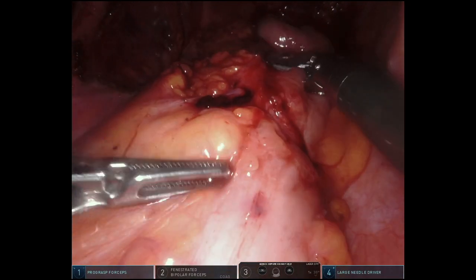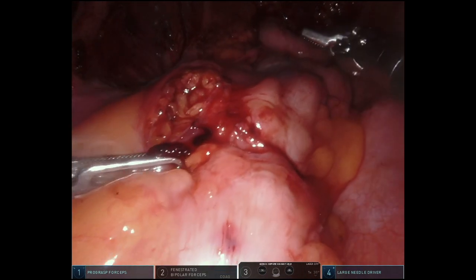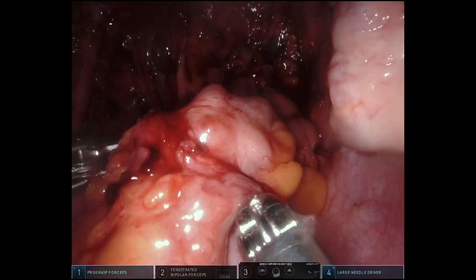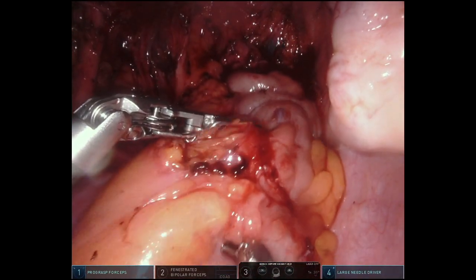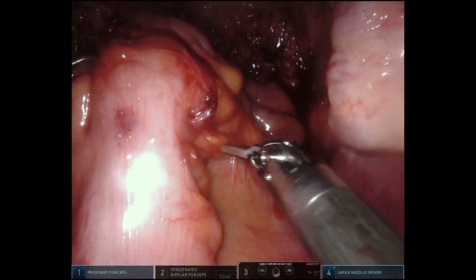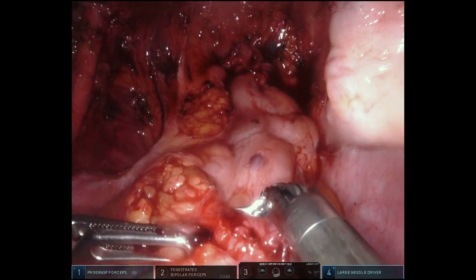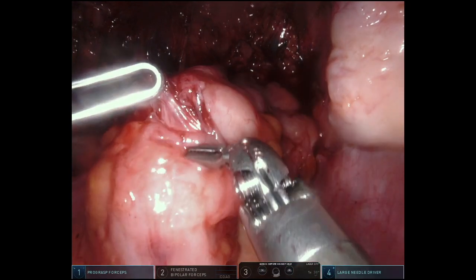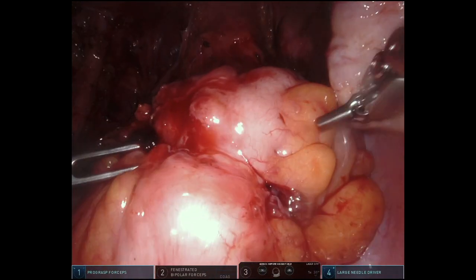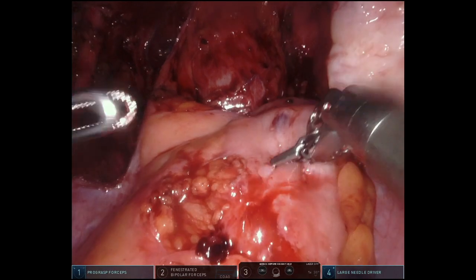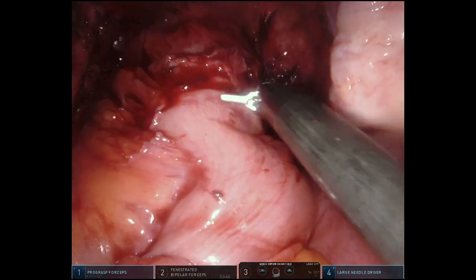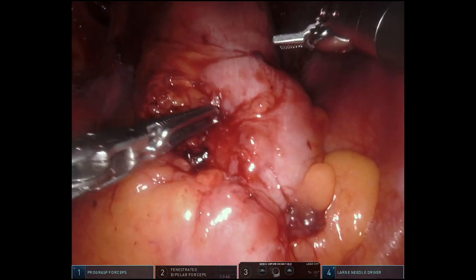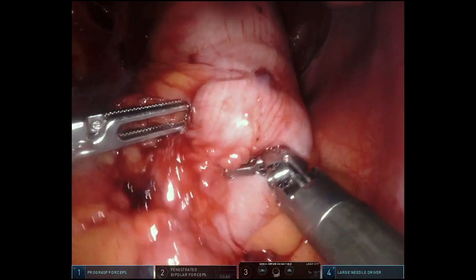When feeling between the two instruments using visual proprioception and visual tactile sensation, one can feel that there is a very hard nodule within the wall of the bowel. This lesion was not preoperatively diagnosed, as it is high enough that it typically will not show up on an MRI and also cannot be felt on a rectovaginal exam. It appears to be in the anterior wall of the bowel and small enough in size that we believe we can remove it with a disc excision with double layer suture repair technique. It is generally our preference to advance an EEA sizer underneath the lesion before performing the disc excision, but one can see that the lesion is high enough that it is difficult to reach, and once we do reach, there is a stricture that prevents one from passing the sizer underneath the lesion.